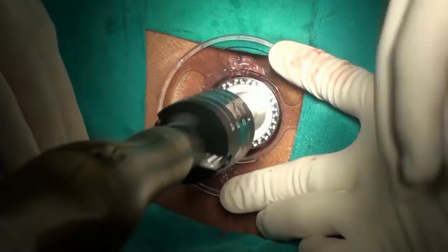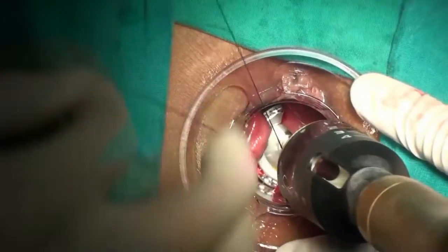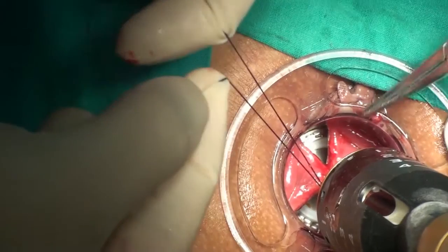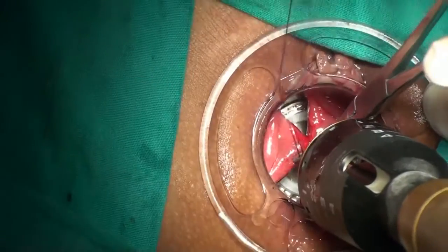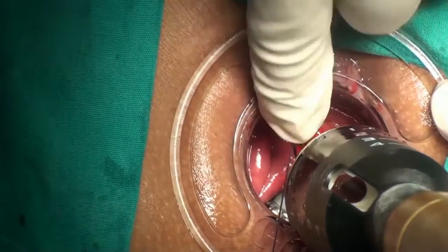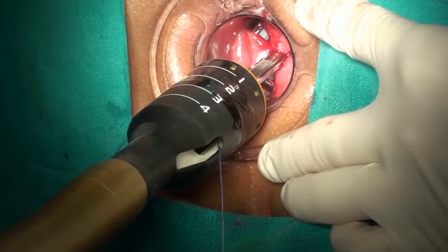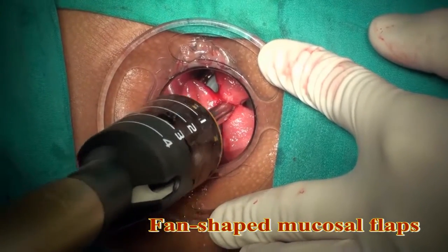The anvil of the stapler was introduced and positioned above the suture, which was tied down to the rod. Pieces of the mucous membrane were pulled into the barrel of the stapler by the traction suture to form three fan-shaped mucosal flaps.